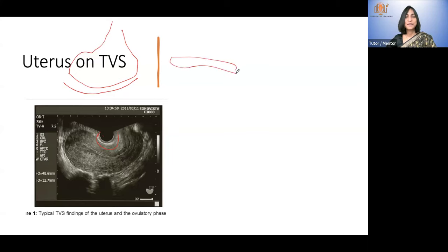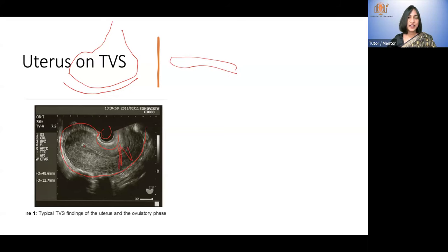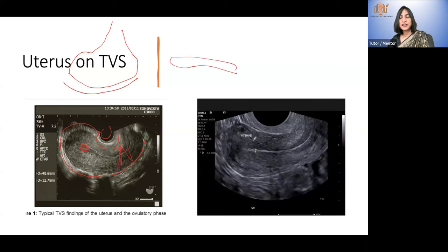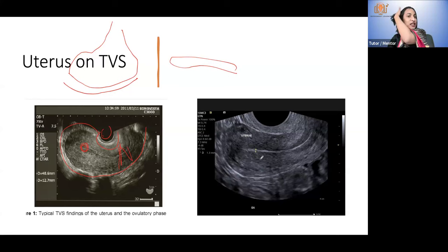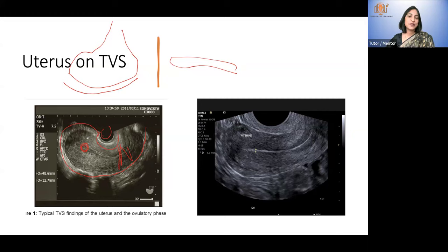A TVS probe is smaller and elongated. On TVS you can see the body of the uterus, the myometrium, the cervix, and the endometrium. If she gets pregnant, this is where you see a gestational sac — black inside and white outside. Another picture shows trilaminar endometrium versus thin endometrium, but that is not part of today's discussion; we will cover it in the basics of gynecological ultrasound.